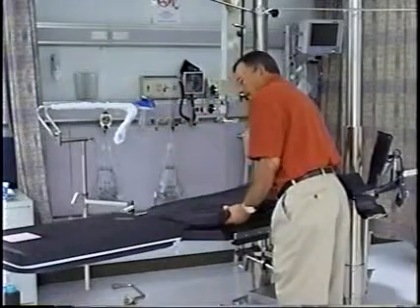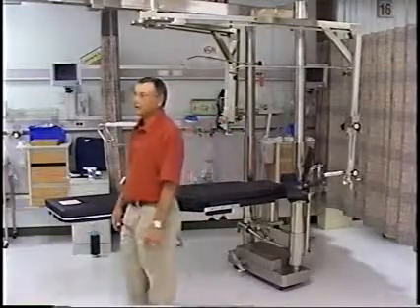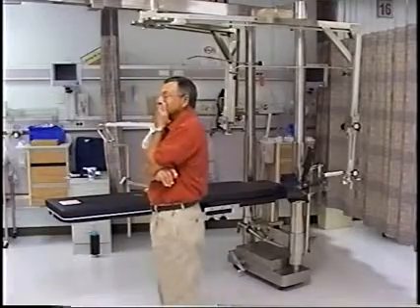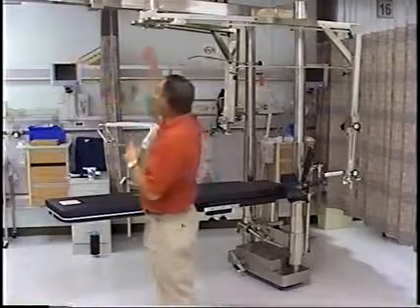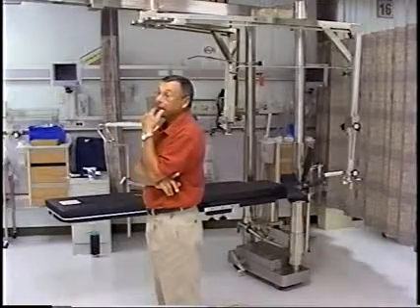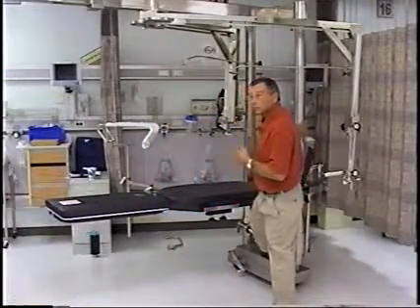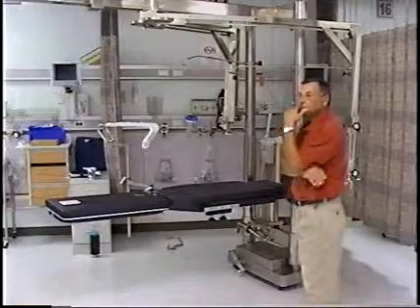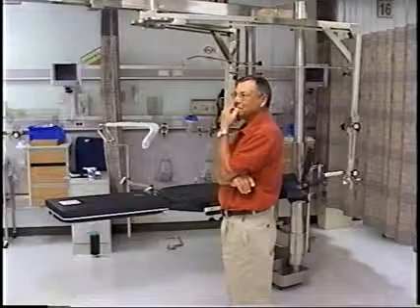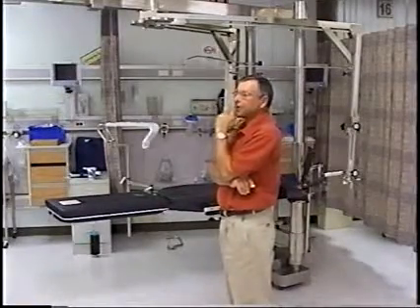How much hydraulic fluid does this thing hold? You had a leak a couple years ago. And I don't know about how much hydraulic fluid. And probably a lot of people don't know that it goes all the way through. Yeah, it goes all the way through. There's probably 4 quarts. I don't remember. Hydraulic fluid can be replaced up here. Yeah, on top. I had to wrap the chucks around it to absorb it, just to get the fluid done. This is an old table, and it's been upgraded.